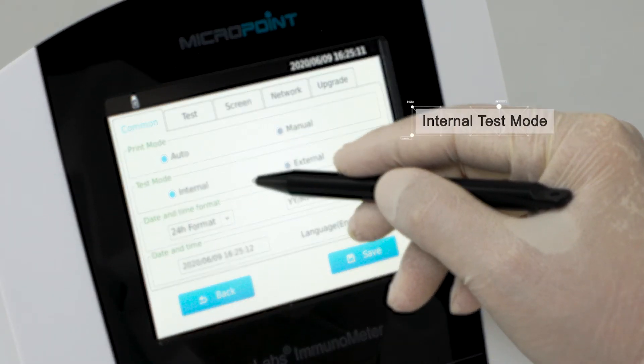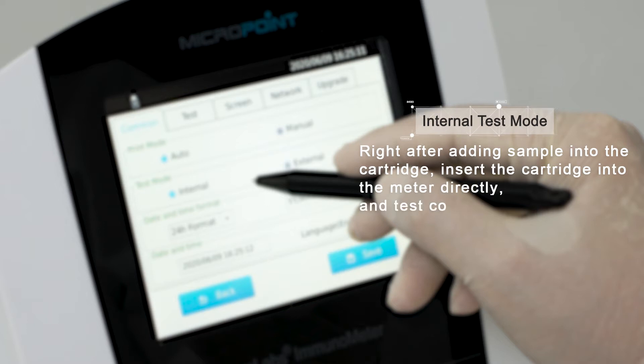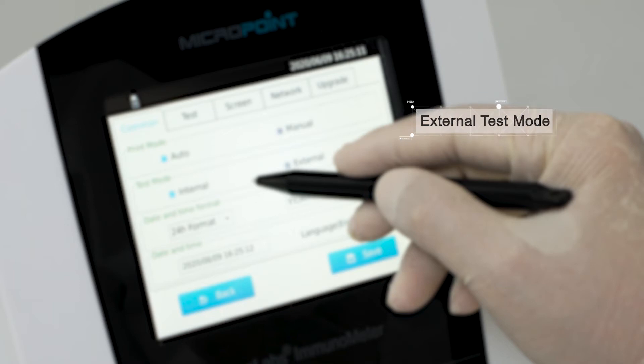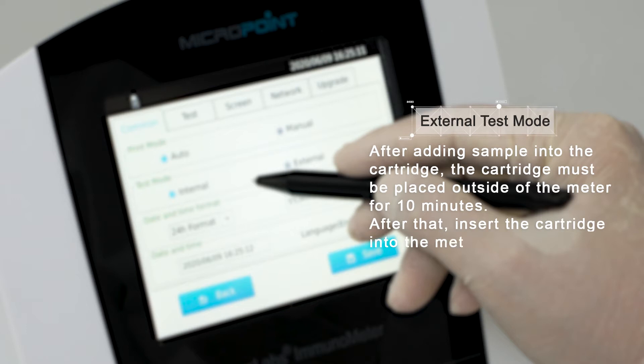Internal test mode means right after adding sample into the cartridge, insert the cartridge into the meter directly and the test completes automatically within several minutes. External test mode means after adding sample into the cartridge, the cartridge must be placed outside of the meter for 10 minutes, after which you insert the cartridge into the meter and the test will be completed within 30 seconds.